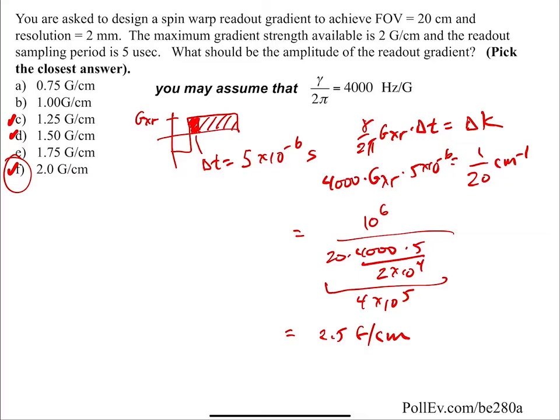Go ahead. If you want a greater resolution, how would making the image that you want to see bigger make sense? You want your delta K in k-space to be smaller to be more accurate, but how does that logically make sense? Imaging a wider area in order to have more. That's a good question.